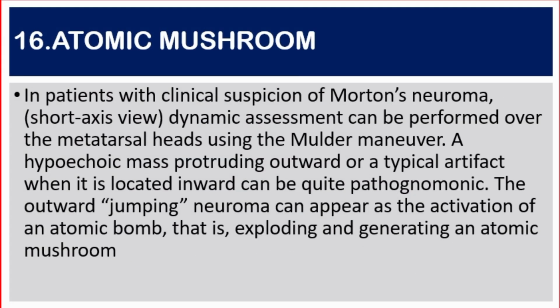Number 16. Atomic mushroom. In patients with clinical suspicion of Morton's neuroma, short axis view, dynamic assessment can be performed over the metatarsal heads using the Mulder maneuver. A hypoechoic mass protruding outward or a typical artifact when it is located inward can be quite pathognomonic. The outward jumping neuroma can appear as the activation of an atomic bomb that is exploding and generating an atomic mushroom.